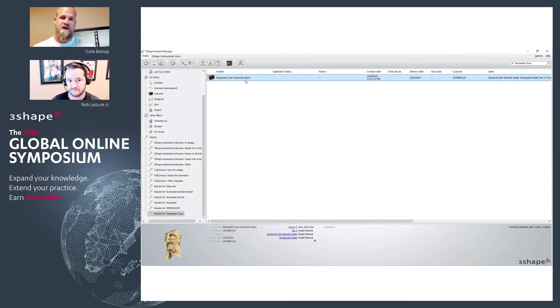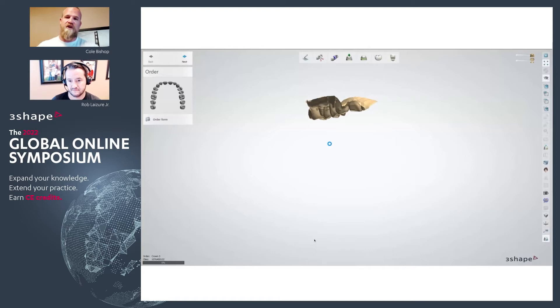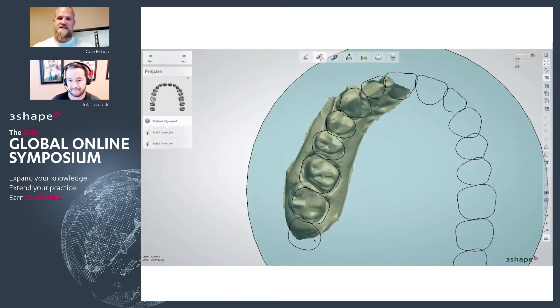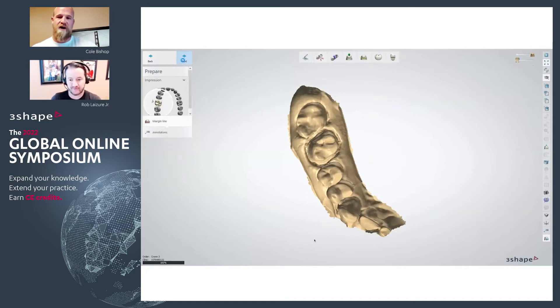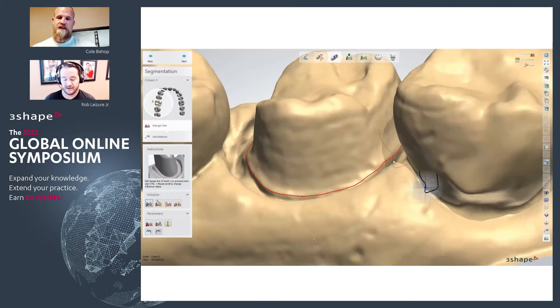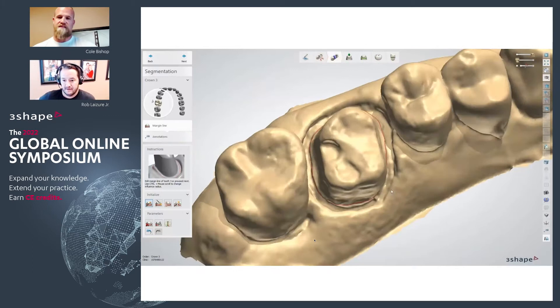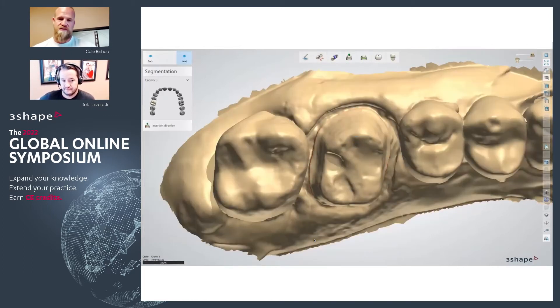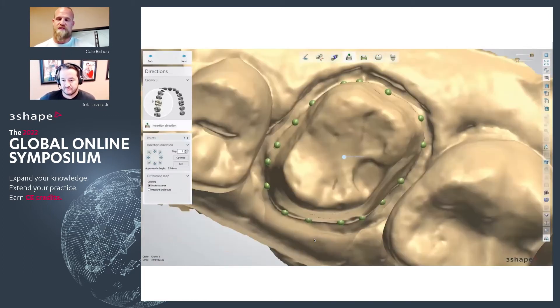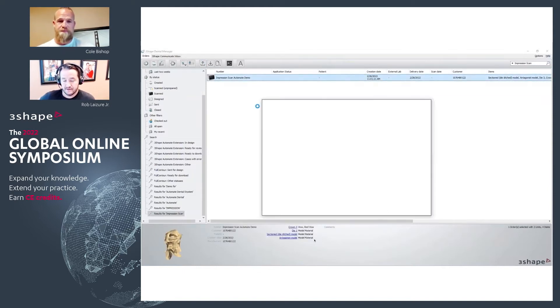As Rob mentioned prior, it's always a good idea to go in and mark your margins so you can keep that all the way through the process. That way when you go into model builder it's going to maintain that same margin. It would actually be required to mark the margin if you want the crown and the model to share the exact same margin line — so highly recommend marking your margin so that the shared margin line is consistent between both the crown design and the die.